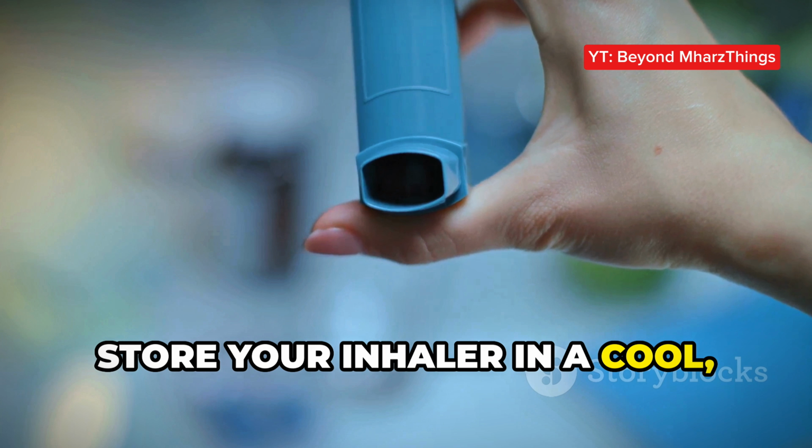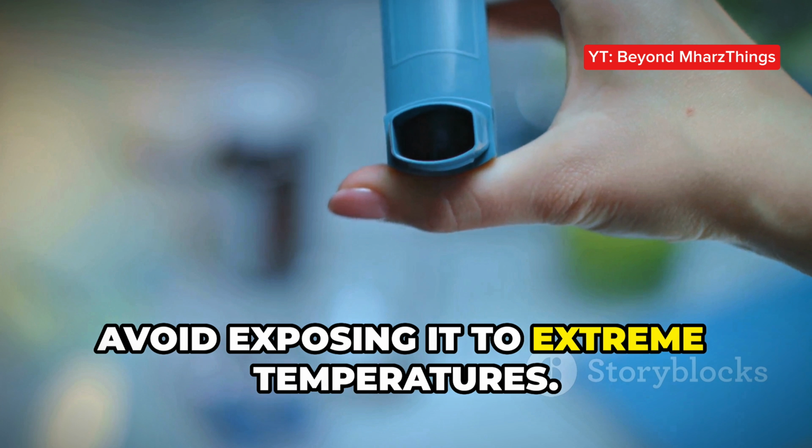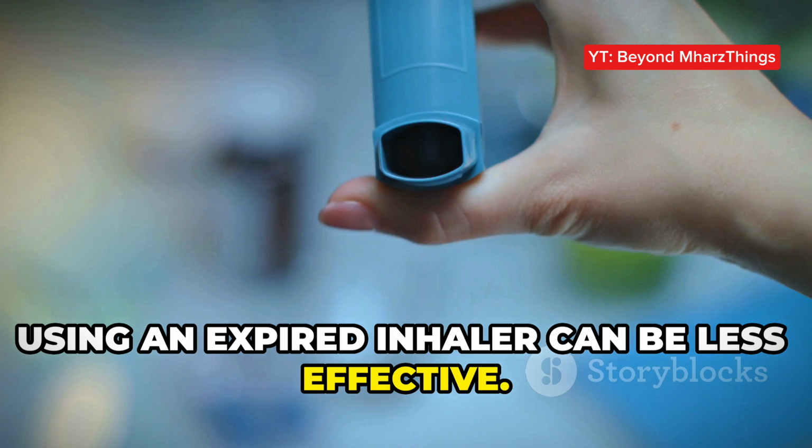Store your inhaler in a cool, dry place to maintain its effectiveness. Avoid exposing it to extreme temperatures. Always check the expiration date on your inhaler. Using an expired inhaler can be less effective.